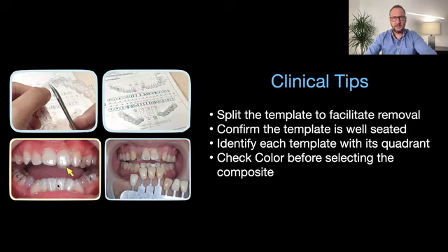It's always important and interesting for you to check the color of the crowns, okay? So you can use a proper composite to be as aesthetic as possible for the patient, okay? But if you only have one, if you want to select one, I would use a very clear and transparent attachment. There are those for incisal edges. They can kind of camouflage the color of the teeth, okay?